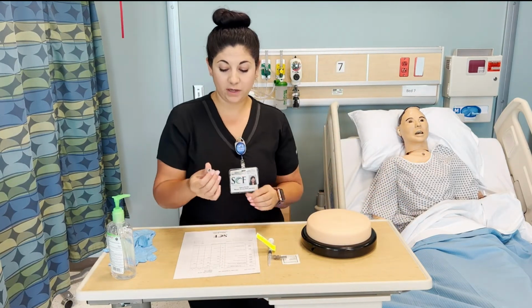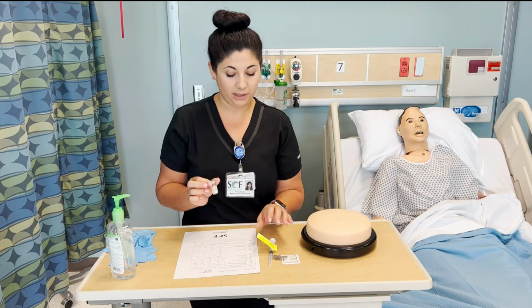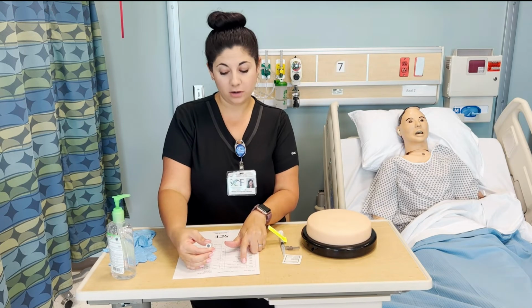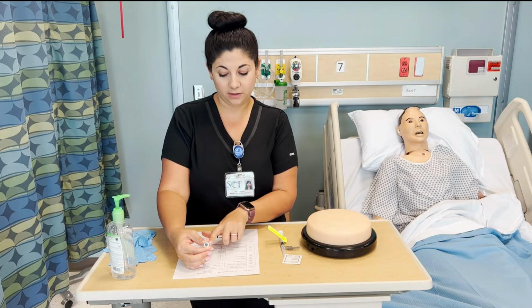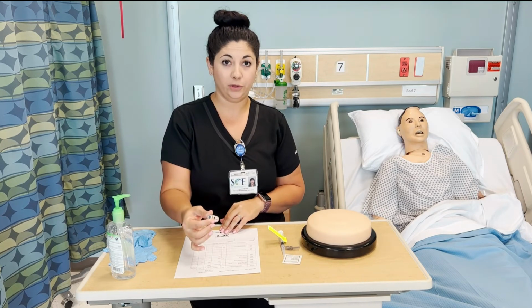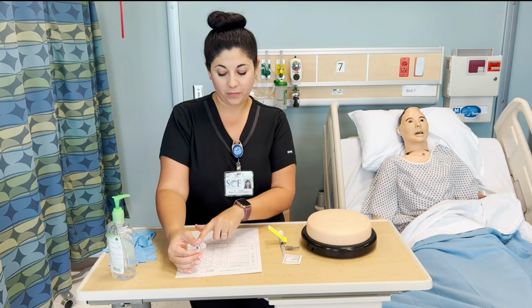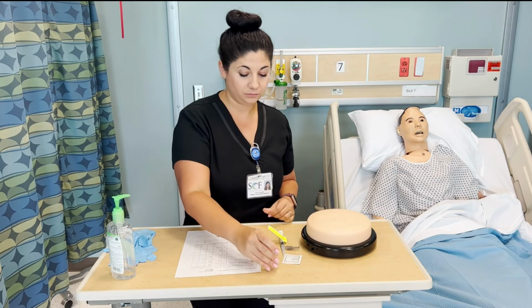Now I'll check my medication using the vial that the medication came from, not my handwritten label. I will state the medication name on the MAR and on the vial, the medication dose on the MAR and on the vial, ensuring that my calculations are correct and I am giving 0.5 milliliters. I will double check the route is IM and that the time is appropriate as well as the frequency.